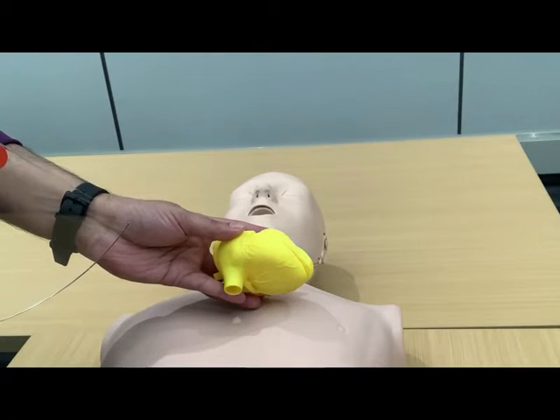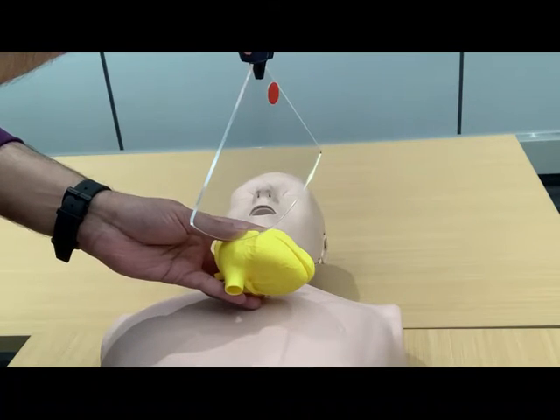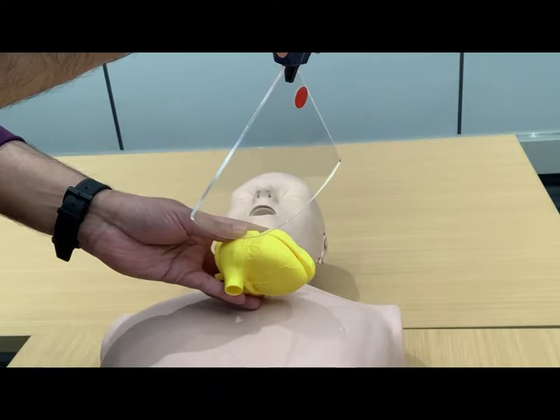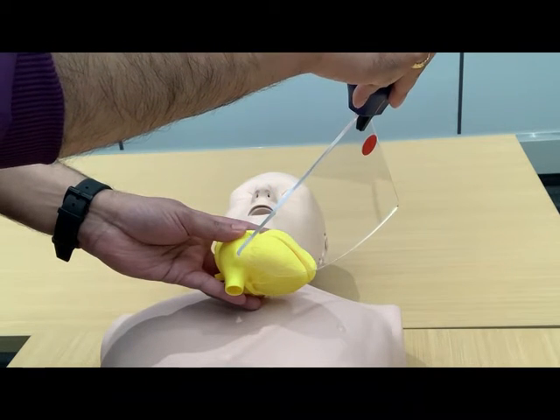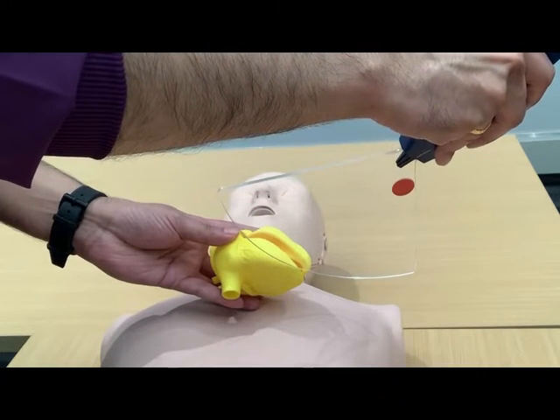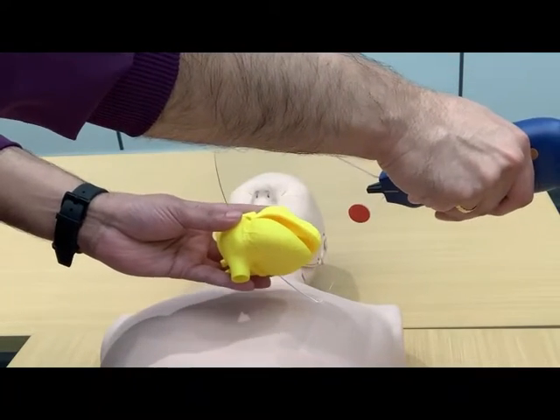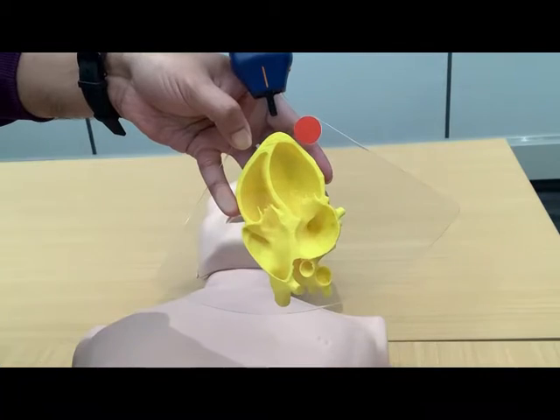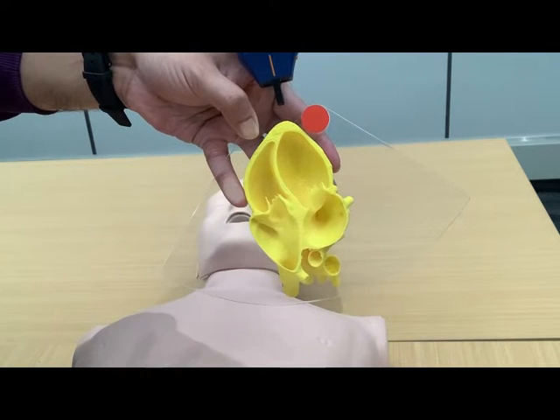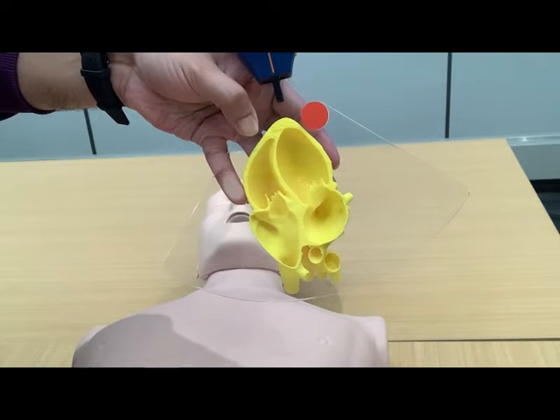To get the apical four chamber view, you slice the heart in its coronal plane. To do that, you start at the parasternal short axis view level where your orientation marker is towards the patient's left shoulder. You slide the transducer inferiorly and laterally until you reach the cardiac apex. From there, you gently rotate the transducer such that the orientation marker is still towards the patient's left but at the two to three o'clock position, then look upwards to slice the heart in its coronal plane. Ventricles are represented on top of the screen, and because the probe orientation marker is towards the patient's left, the left-sided chambers will be on the side of the screen indicator.